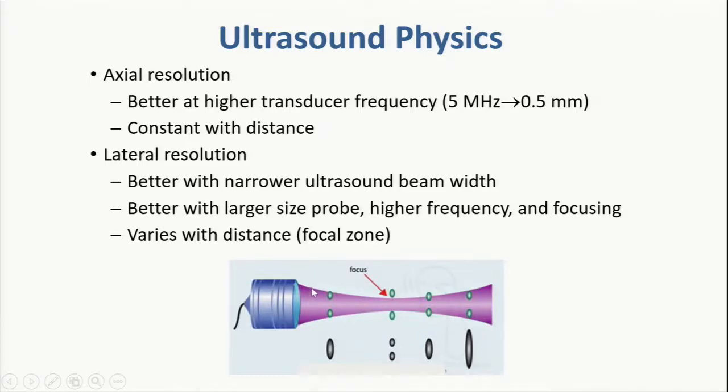So the ultrasound beam can have a width. Here it's wide. It becomes narrower and wider again.